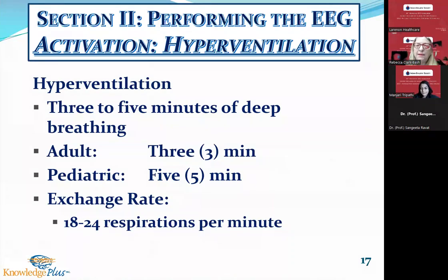It's important not to use the word hyperventilation. That may cause patients with anxiety to get very amped up, get very nervous that they're going to go into an uncontrolled hyperventilation. So I call it the deep breathing exercise. And during that time, it's important to tell your patients their fingers and toes might get numb and tingly. It's important to tell the patient that they might get dizzy, that those are all normal steps.